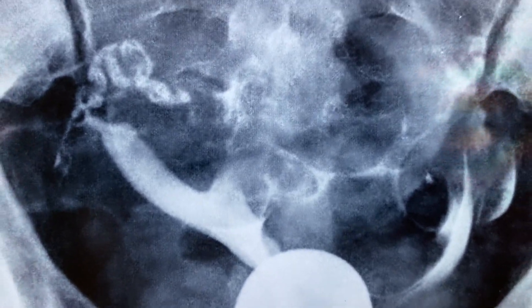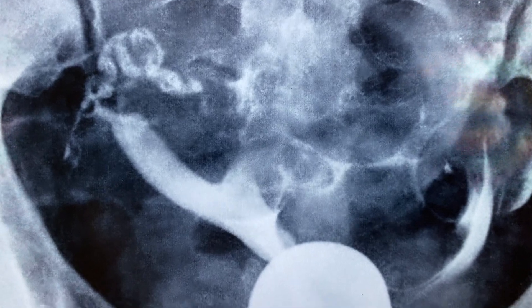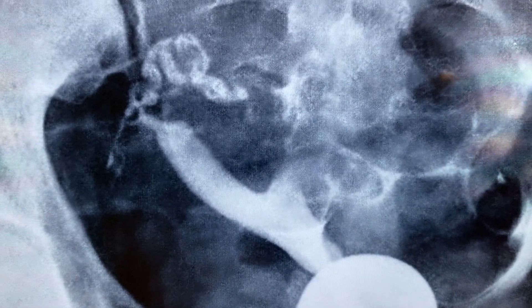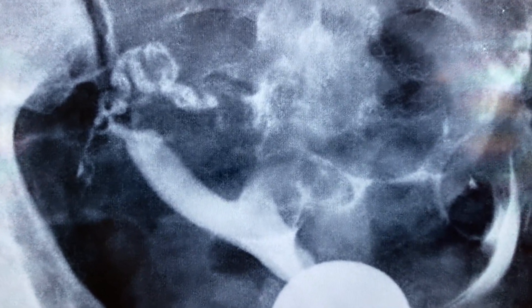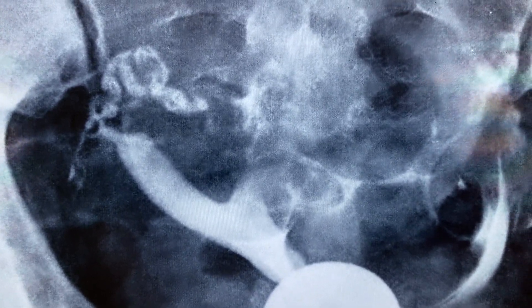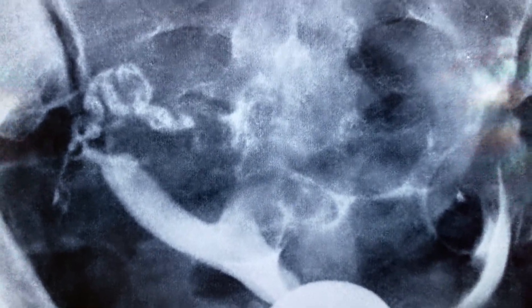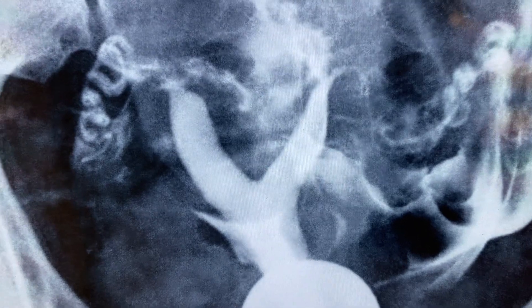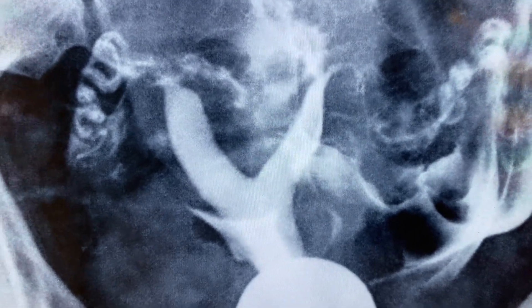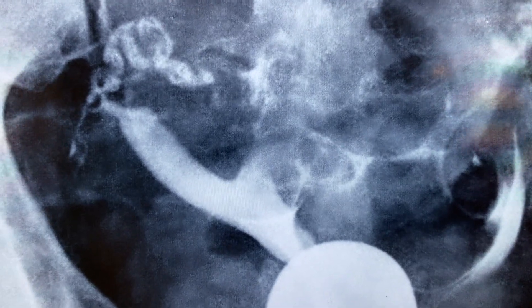There is a very common mistake during hysterosalpingography for cases of uterine anomaly when you have this view of a unicornuate uterus. But before putting the conclusion of a unicornuate uterus, you should exclude that the cannula didn't go far enough, or that the cannula went too far inside one cornua where there is actually a septum. When the cannula of hysterosalpingography goes into one cornua, you get this appearance of a unicornuate uterus.